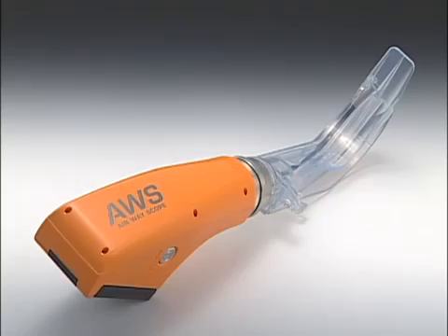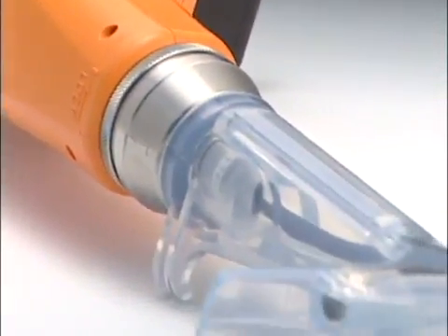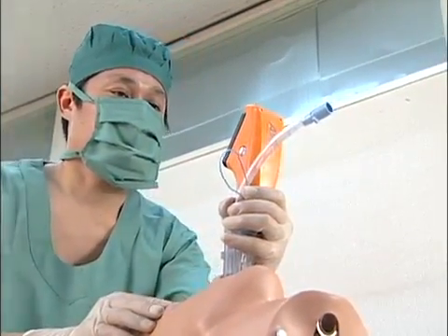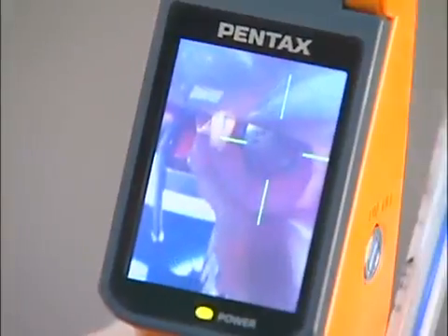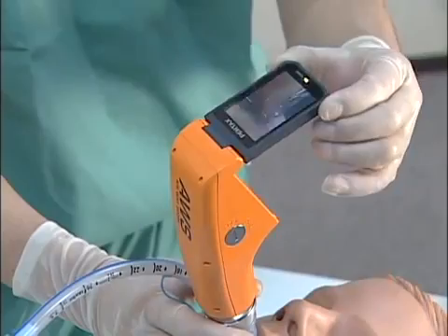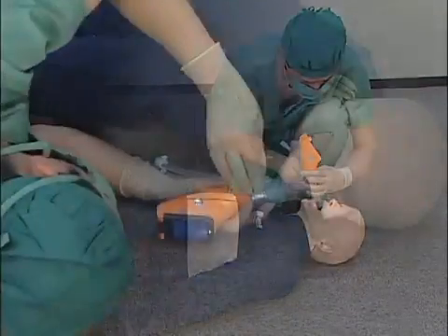Pentax's video laryngoscope, Pentax AWS, displays images on a monitor without extending the patient's neck. Its target symbol supports smooth tracheal intubation. With Pentax AWS, tracheal intubation can be performed from any position on a patient in any posture by simply adjusting the angle of the monitoring apparatus.